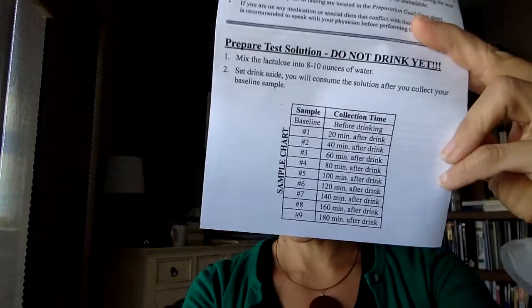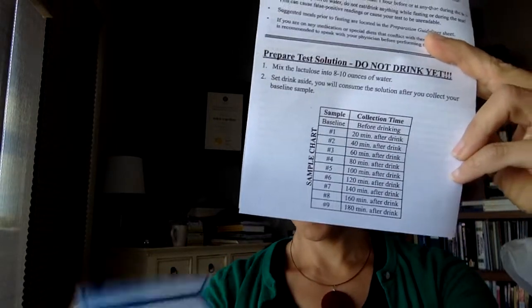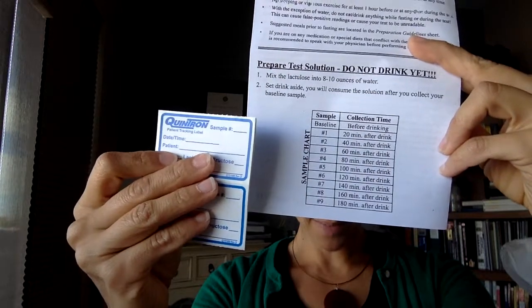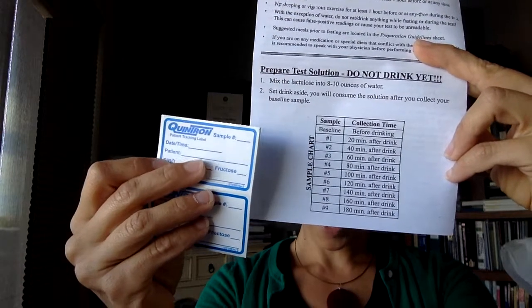How this test is done is that we take one sample first as a baseline. Then we're going to drink the lactulose solution, and that is when your timer starts. You will then be collecting the other samples after that start time. I will demonstrate here with the instructions — this is what the timeline looks like. The first label at the top on the other side, you would write 'baseline,' then write the date and the time that you actually do the baseline sample, and then your patient name.